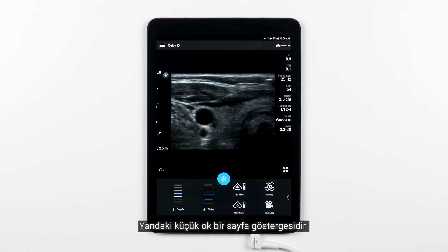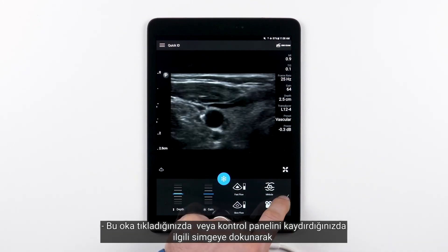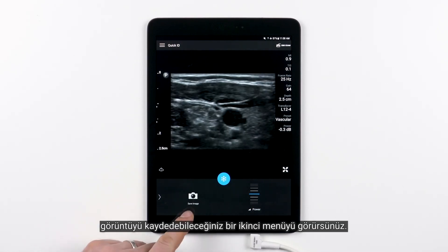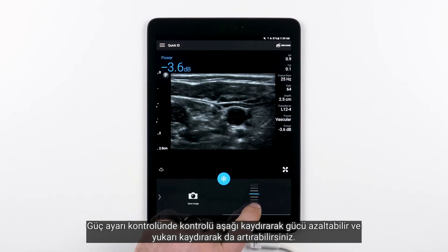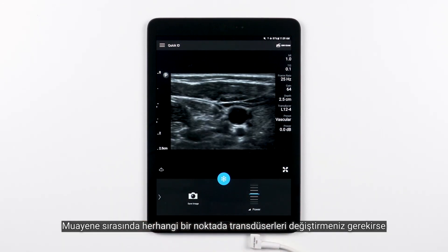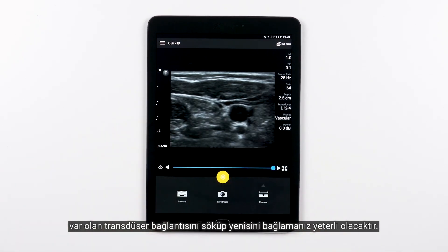The small arrow on the side is a page indicator. If you touch the arrow or slide the control panel, you'll see a secondary menu with the option to Save Image by tapping that icon. Hearing the beep means you've saved an image. On the power adjustment control, sliding down lowers the power and sliding up increases the power. If at any point during your exam you need to change transducers, just simply disconnect the existing transducer and connect the new one.